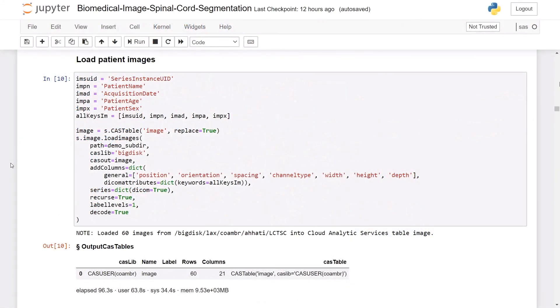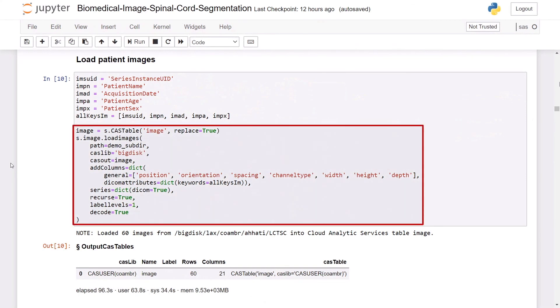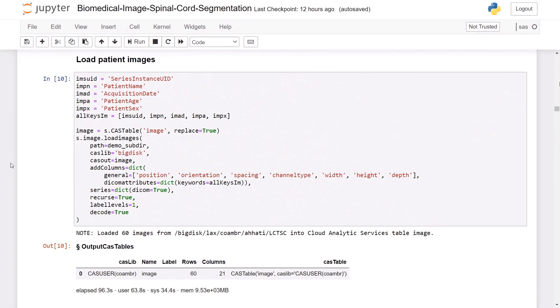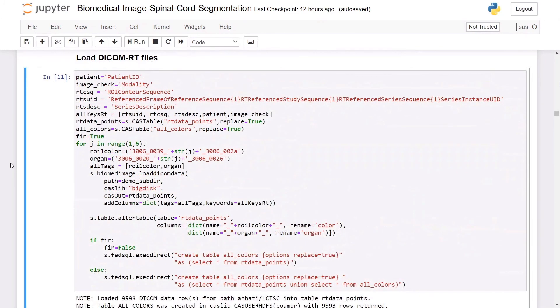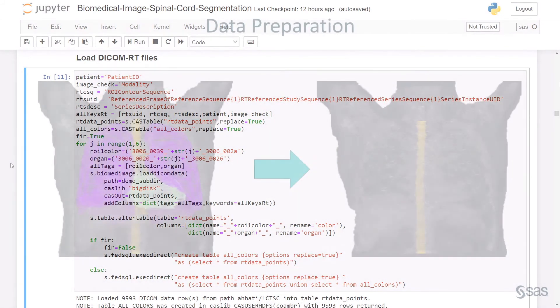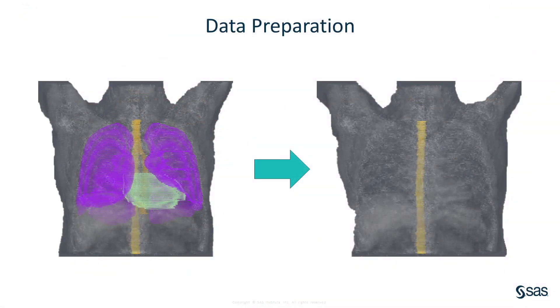The first step in this pipeline is to load all patient images using the load images action. Here I'm loading in 60 images with DICOM metadata such as the patient name, age, sex, and series instance UID. The next step is to load the corresponding DICOM RT data, which contain contours showing exactly where the organs are located within the 60 patient images. Once we have these contour data loaded in, we filter out the other organ contours so that we have only the contours that show where the spinal cord is. Since the spinal cord is labeled in different colors for each image, I'm first finding out what all the spinal cord colors are within the data.